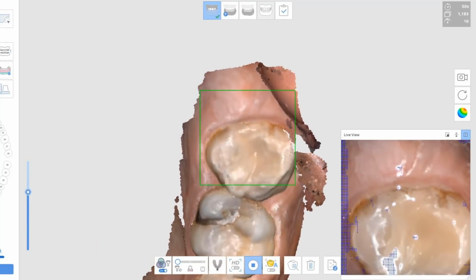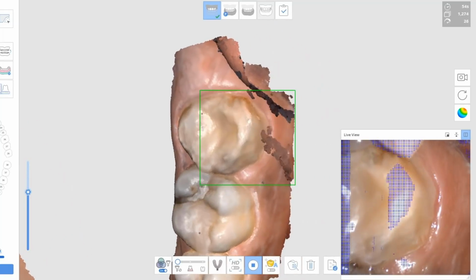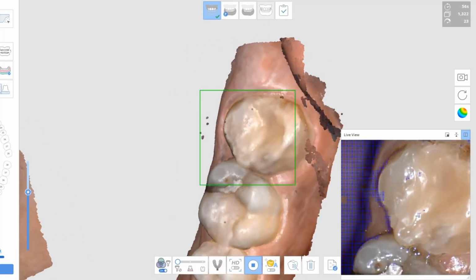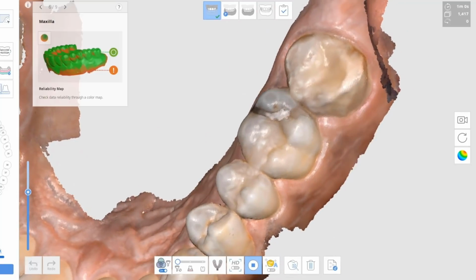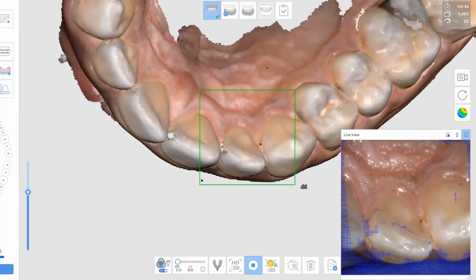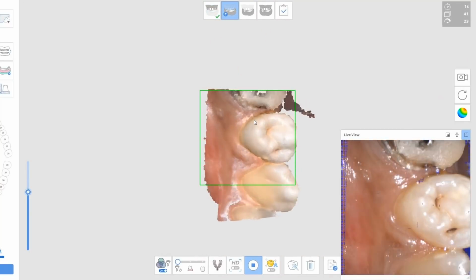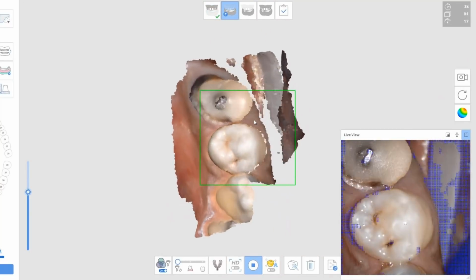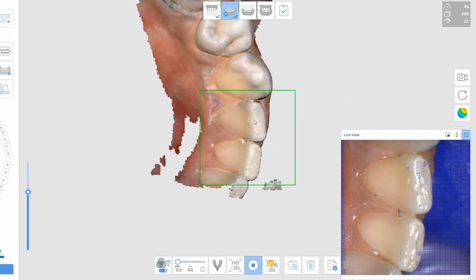I'm just going to use my finger. I'm going to displace the cheek, and now that the camera can see that there's no tissue there and my finger took care of that, it knows that's no longer part of the equation, and it automatically crops it out. So very important that you understand that. I used my finger, the blue glove, and I imaged enough for the software to recognize that that second molar, that extra cheek tissue that I picked up inadvertently, was not part of the equation.